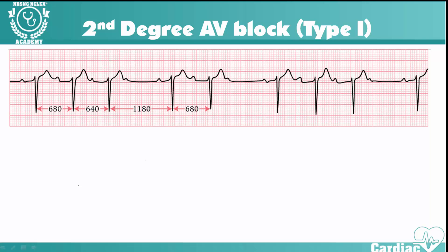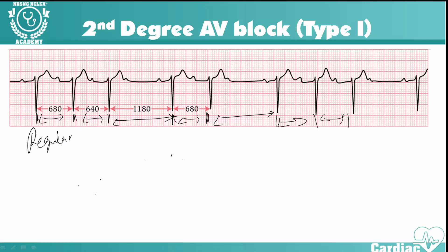For the rhythm: it is not entirely regular. You could say it is regularly irregular. Up to the dropped beat, the QRS complexes come at the same interval, but then there's a big gap, and it starts regular again until the next drop. So it is regular in certain portions then becomes irregular. The heart rate is variable, depending on the underlying rhythm.